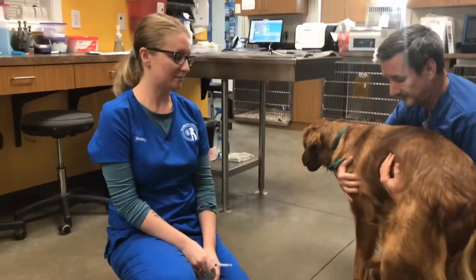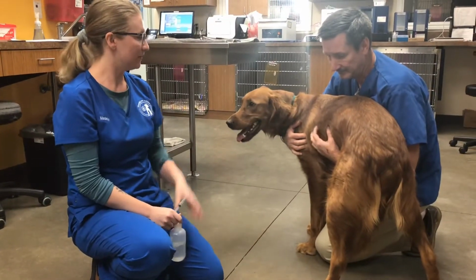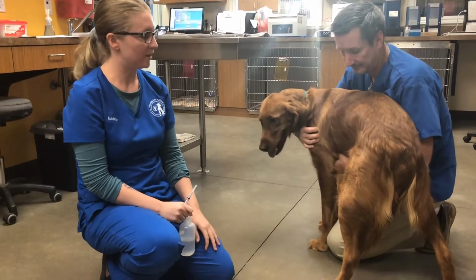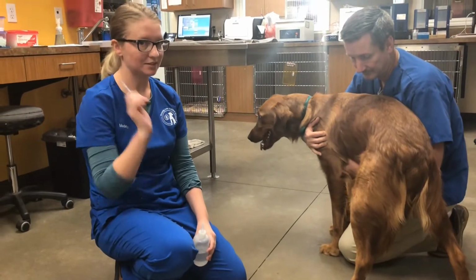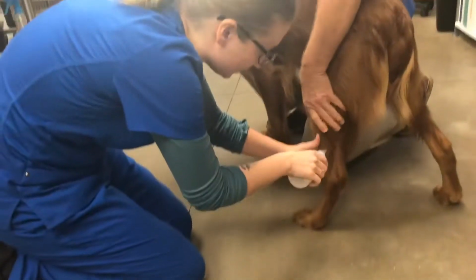Okay, now I will be demonstrating a blood draw from the lateral saphenous vein on a canine patient. Paxton is back, he's doing very good. He's in standing restraint. My restrainer will occlude the vein for me here shortly. I still have my 3 cc syringe with the needle on it, and then my alcohol. So this will, again, sterilize my site and help me visualize the vein better.